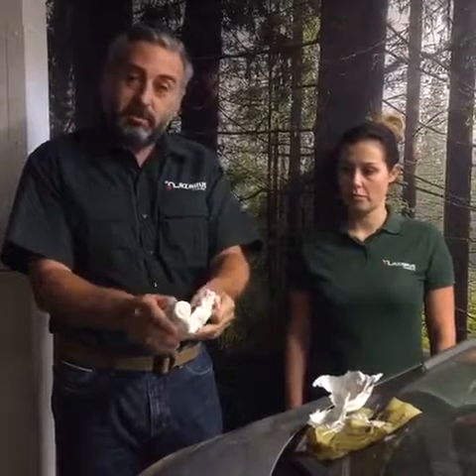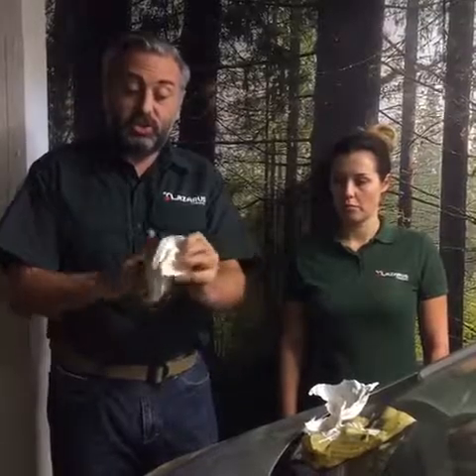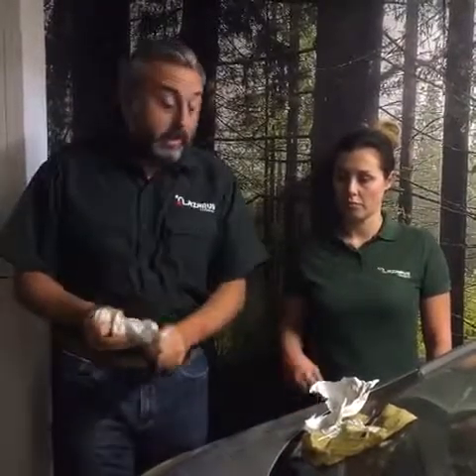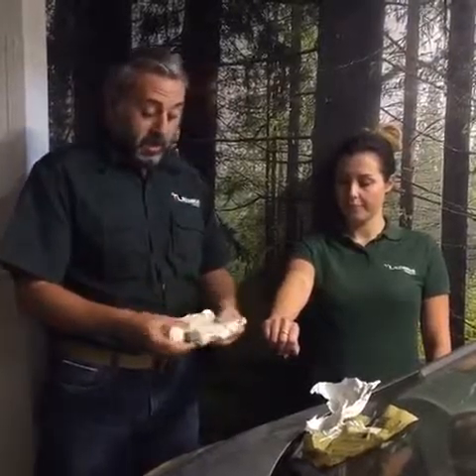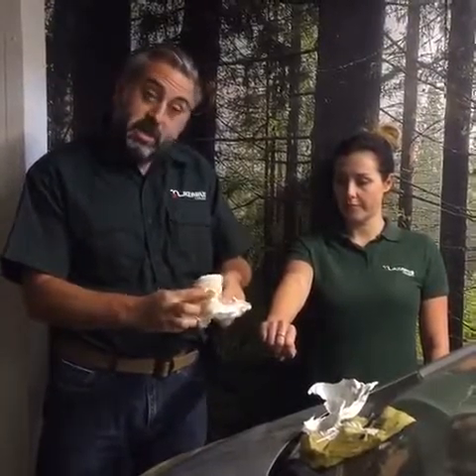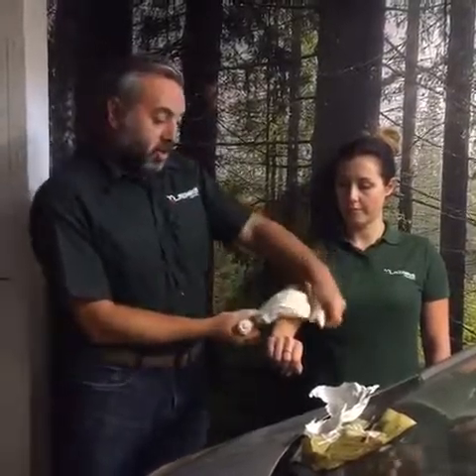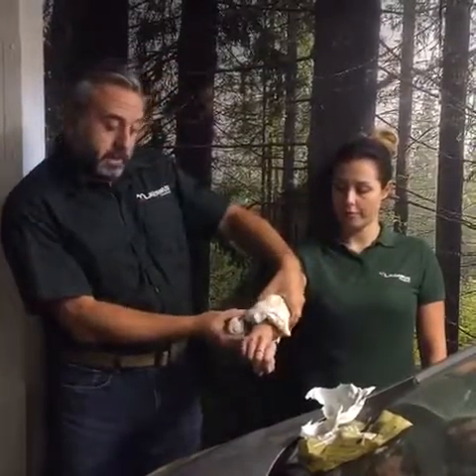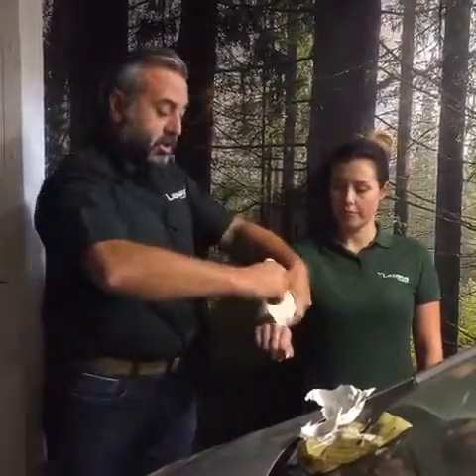When we open it up, what we have is a nice, meaty bandage. It's designed to give you absolutely everything you need. There's a big pad, and then there's stuff to tie it on with. I just need to borrow Kelly's arm and imagine she's got some sort of injury here. The cup that you can see there is your aiming mark, so we get that over the actual wound. It is elasticated, so the idea is you can pull on it and give it a little bit of tension to secure it down.